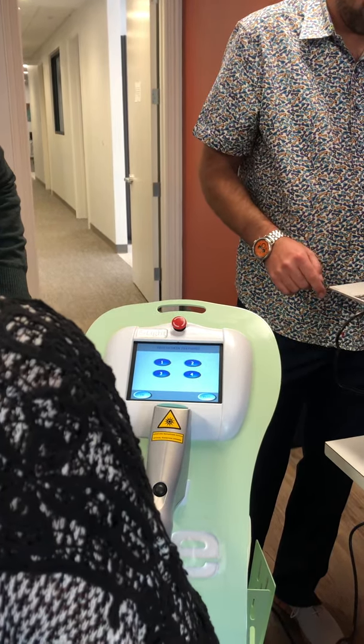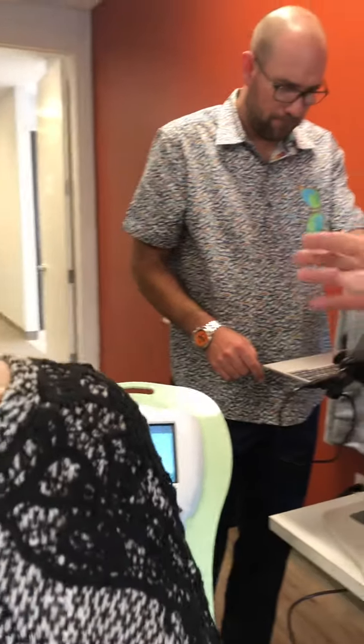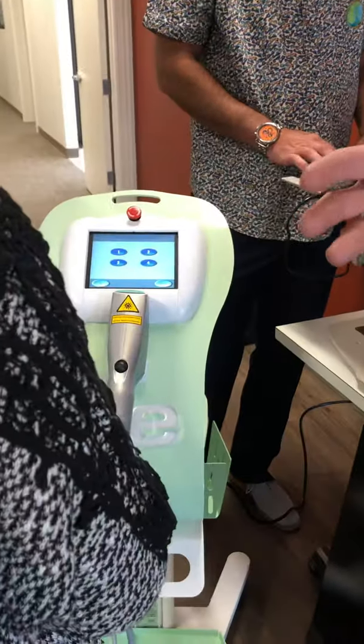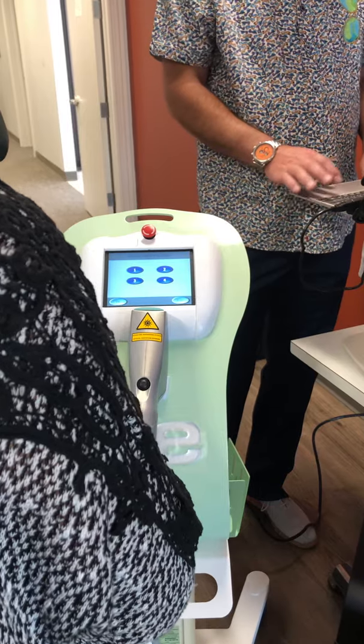So based on her... going off her complaint rather than... Right now I'm going to go off her complaint versus the meibography, because at 2 I can't do any harm and I can only do good. At 3 I'd maybe juice her a little bit more, can't do any harm, but maybe I don't want to treat at that level until I have a better understanding.